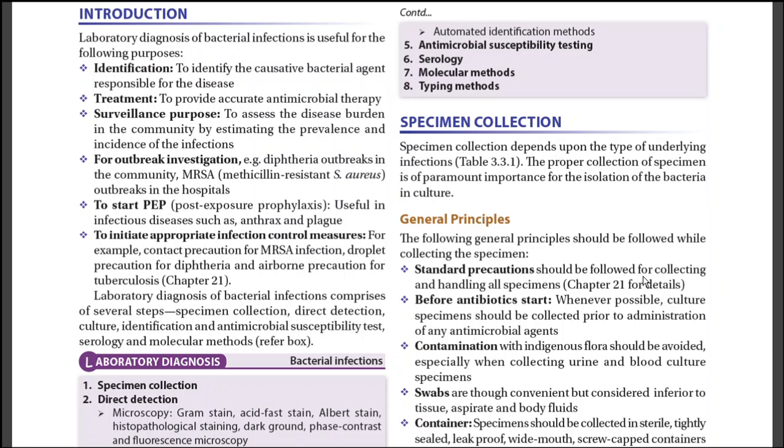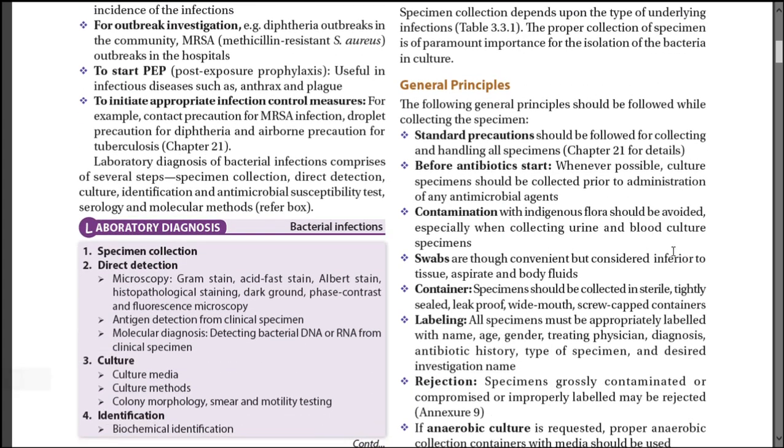Good evening. Today we are going to discuss laboratory diagnosis of bacterial infections. First, let us see what specimen collection is. Specimen collection is nothing but collecting the required bacterial samples which obey the following principles.